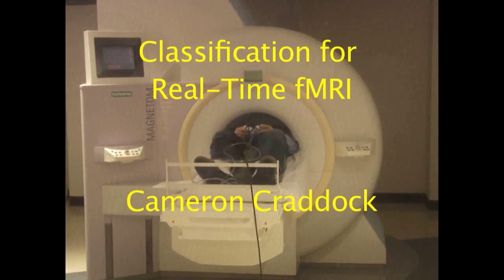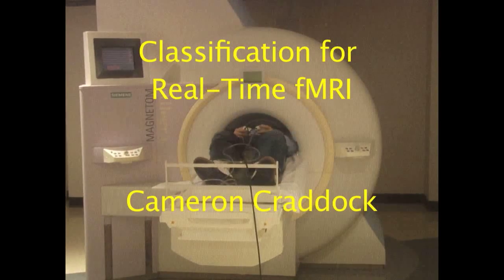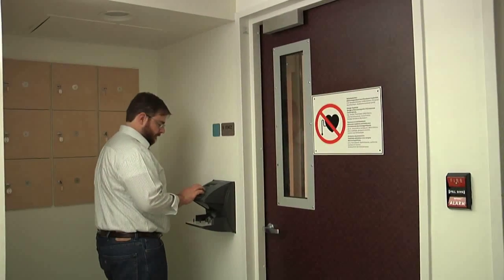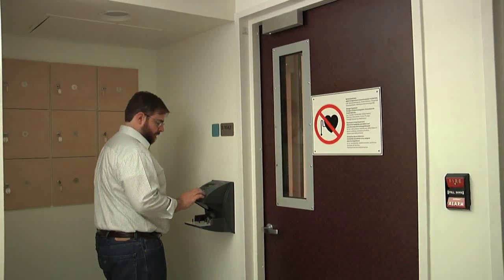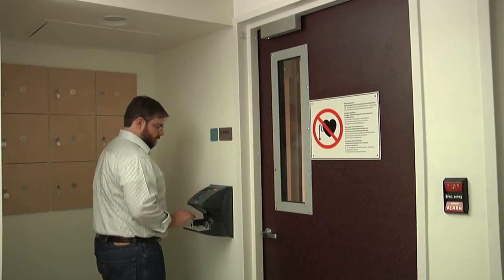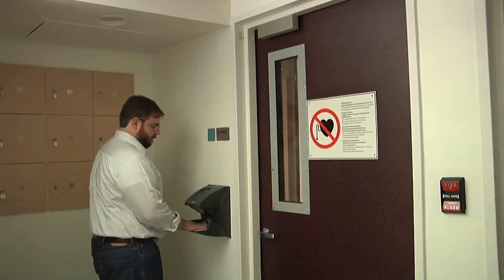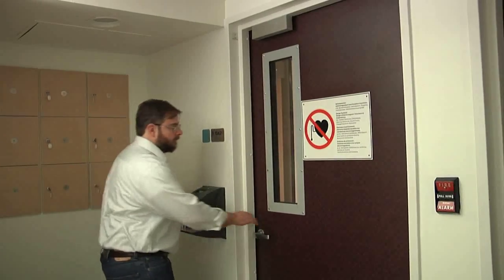Hello, this is Cameron Craddock. I am visiting Dr. Stephen LeConte's lab at the Baylor College of Medicine to learn about their approach for performing real-time fMRI.